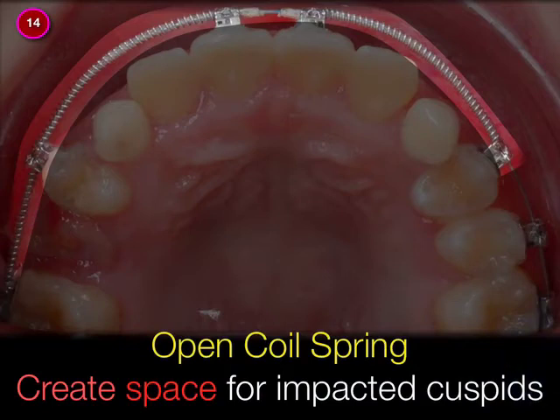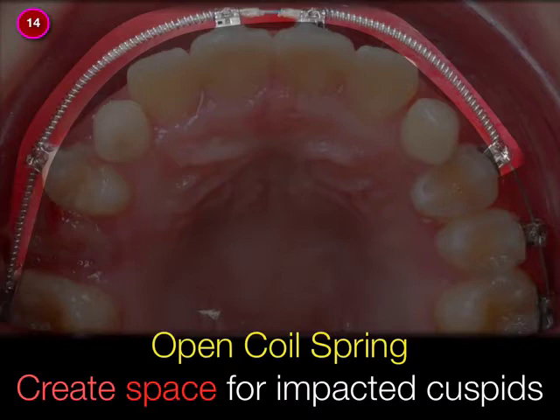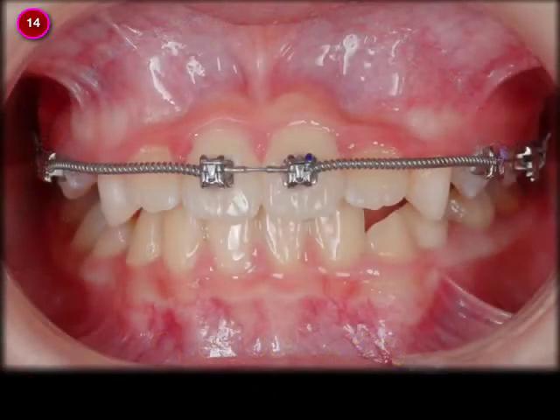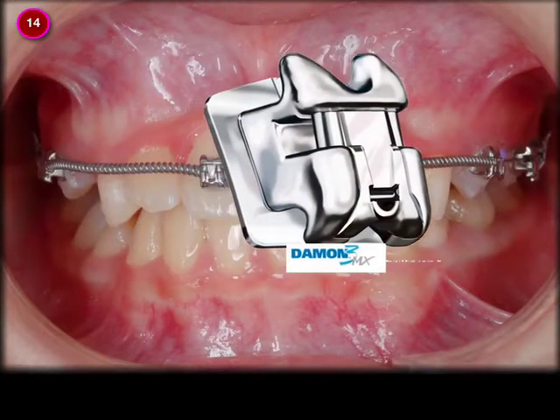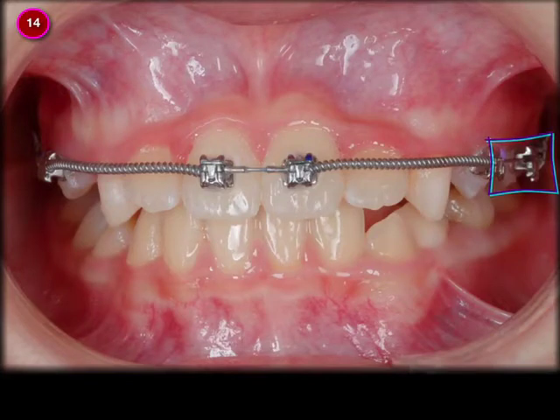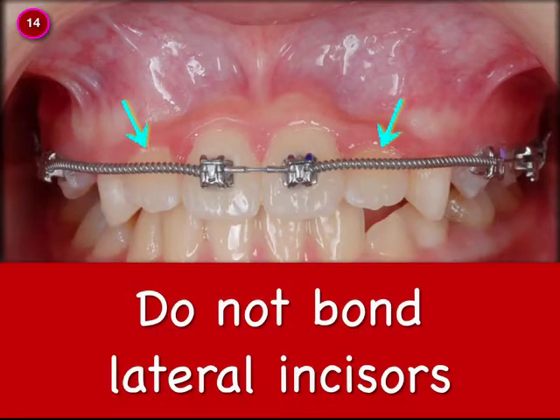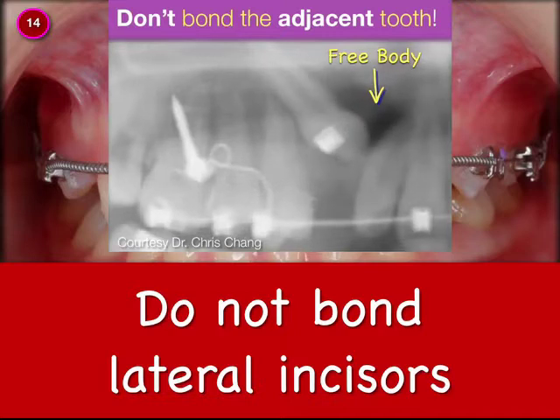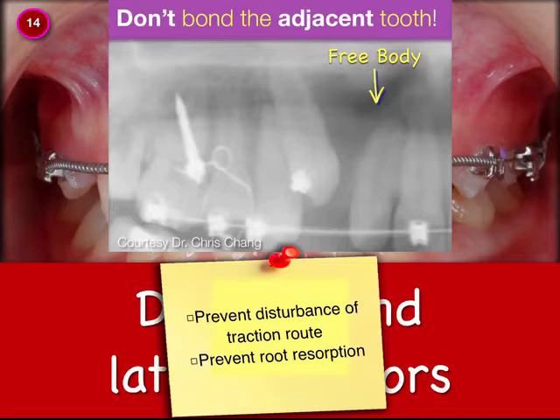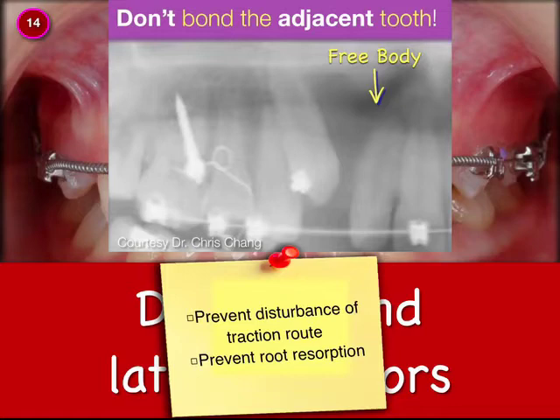In the 14th month we inserted an open coil spring to create space for the impacted canines. We also changed to Damon 3MX brackets. Notice to always remember to close up the bracket slot. Also notice that we did not bond the lateral incisors, because we want the lateral incisors to act as a free body — to prevent disturbance of the traction road and also prevent root resorption of the lateral incisors.